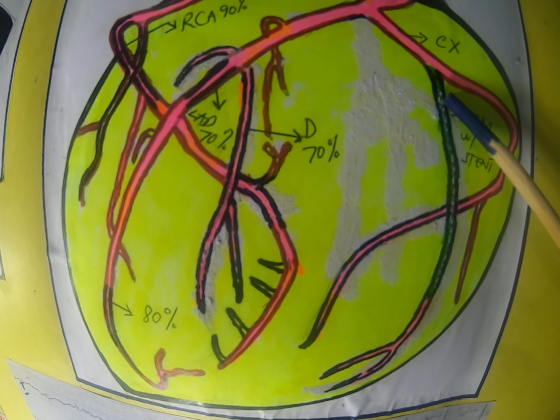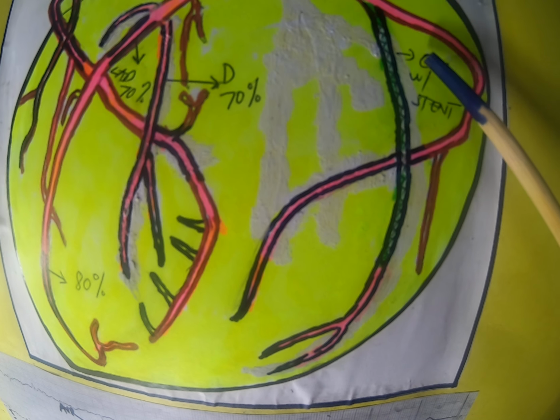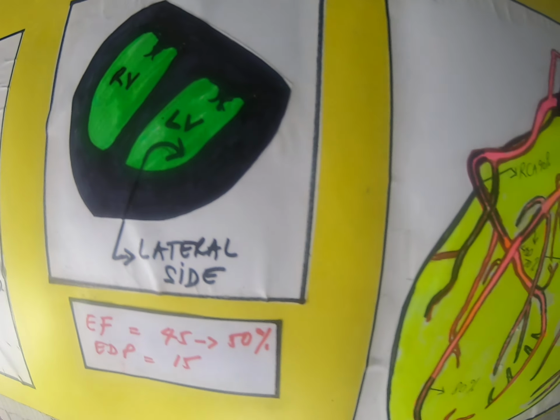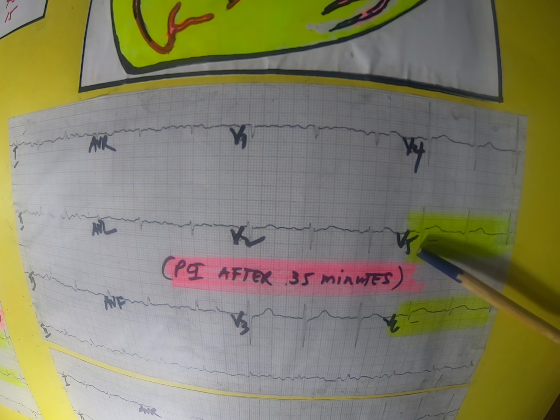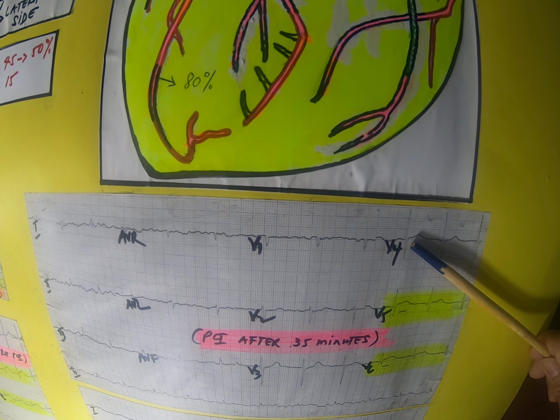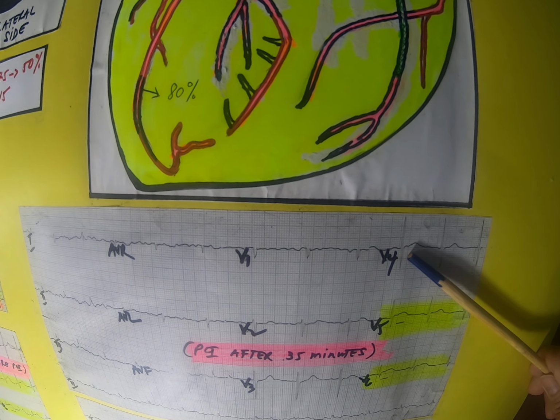So we open up the blocked coronary branch here. The blocked OM is opened up with a stent, and we revive the flow to the lateral side of the left ventricle. So that's good. We did not sustain any Q waves, which are a sign of infarct, and that's good. And what did we do here? With the success of this stent insertion, we are making the evolution and duration of the STEMI shorter, and we are preventing complications.